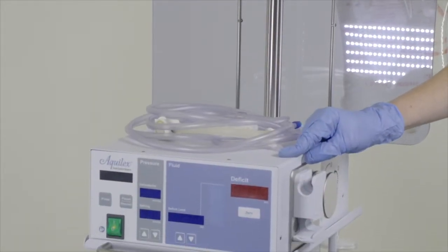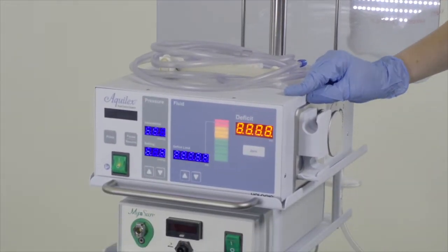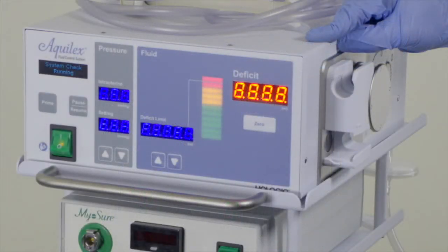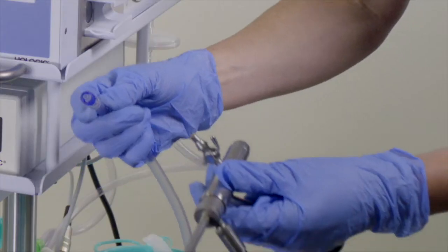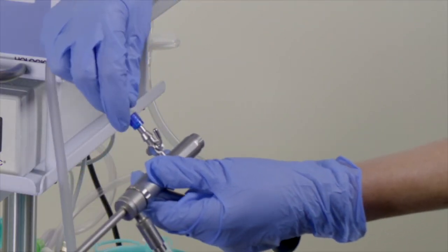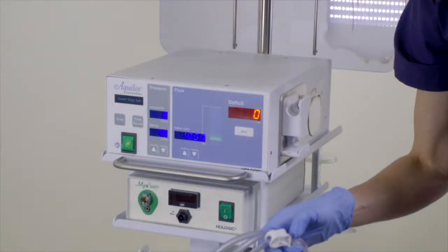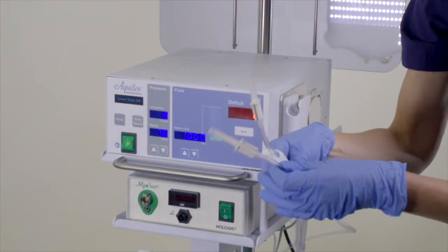Switch on the Aquilex. The system will perform a calibration check which takes a few seconds, and then an audible sound will be heard to let you know it's complete. The screen will say System OK. Attach the blue luer lock tip to the inflow port on the scope. Then hand the two spikes to the circulator.